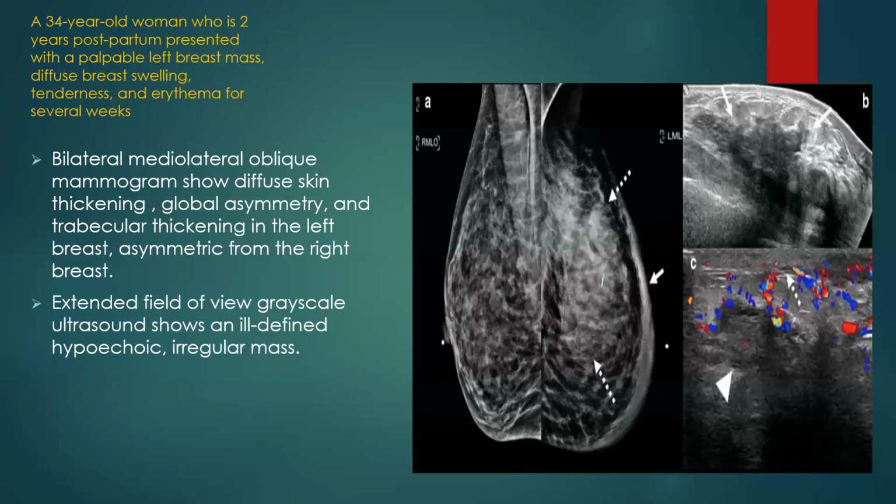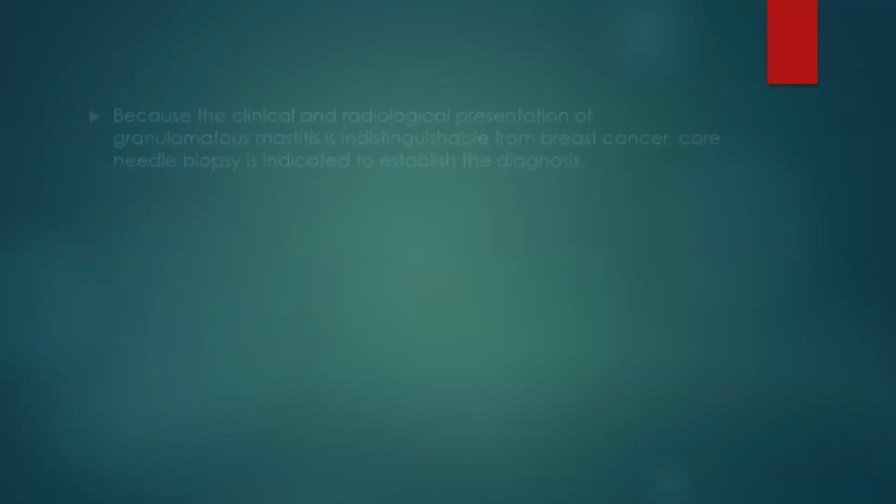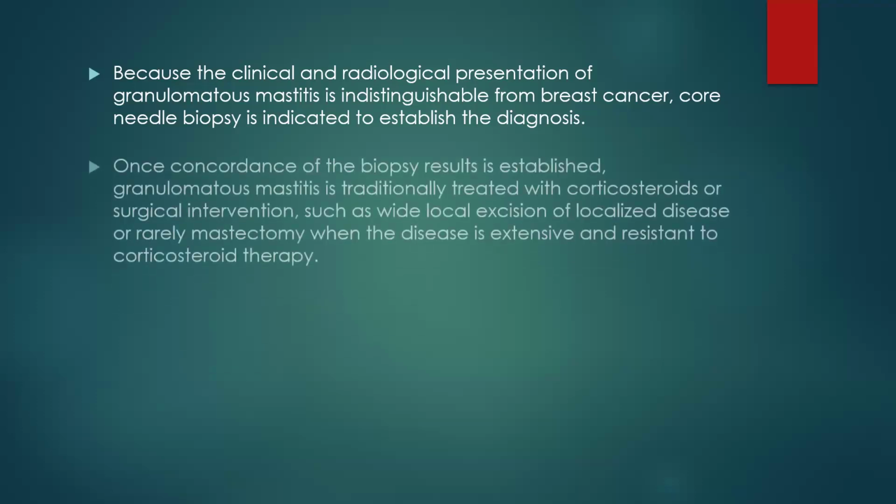Extended field of view grayscale ultrasound shows an ill-defined hypoechoic irregular mass. The color Doppler ultrasound shows increased vascularity, edema, and skin thickening. Because the clinical and radiological presentation of granulomatous mastitis is indistinguishable from that of breast cancer, core needle biopsy is indicated to establish the diagnosis.